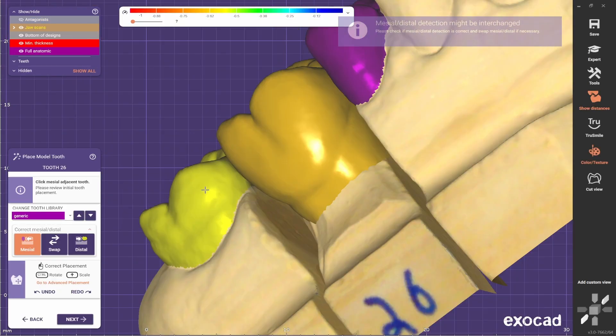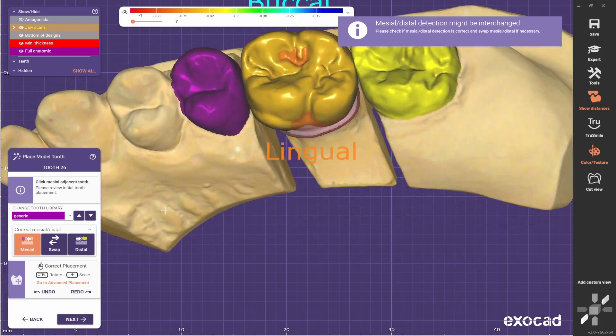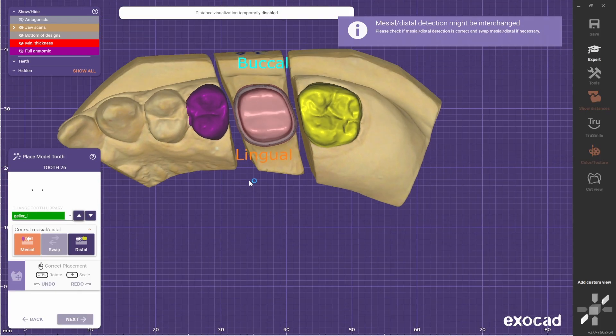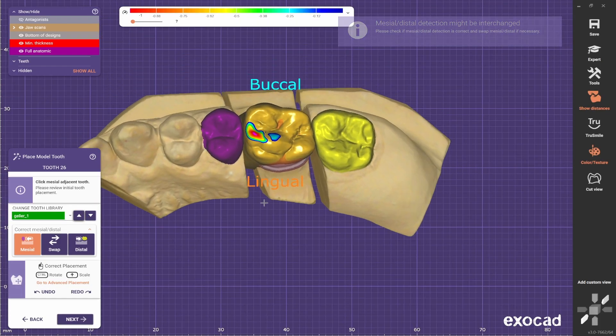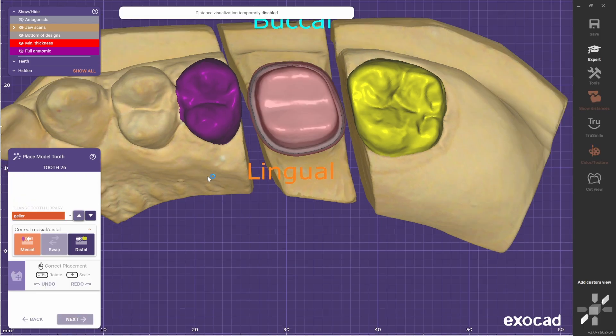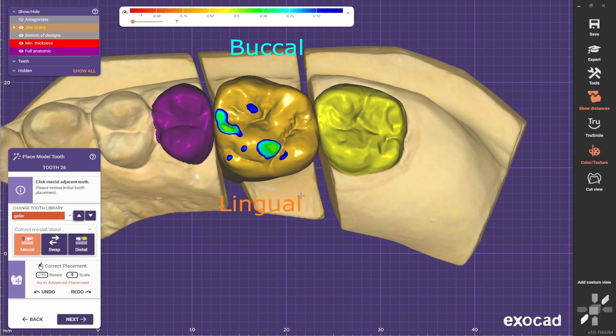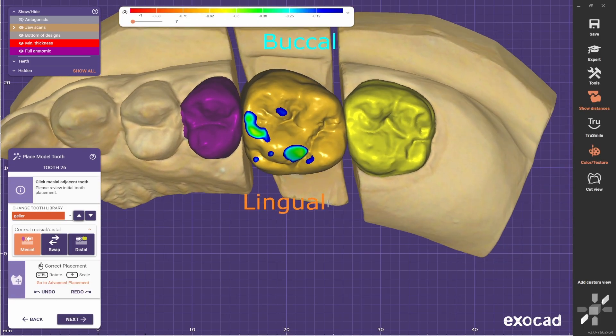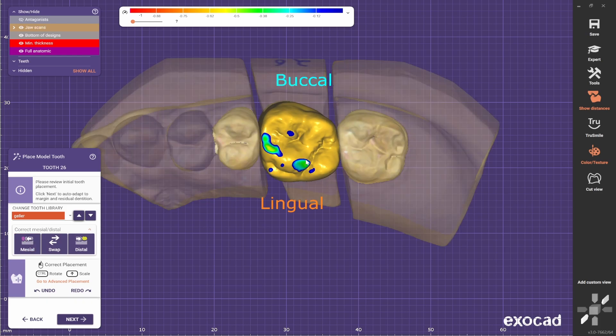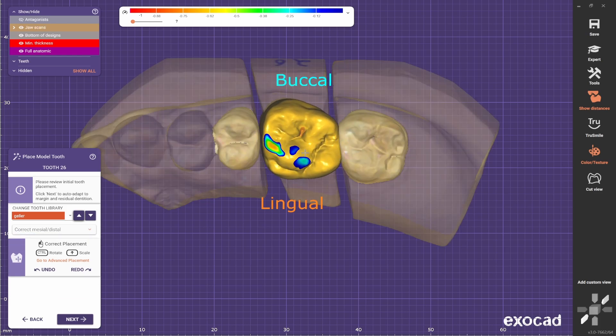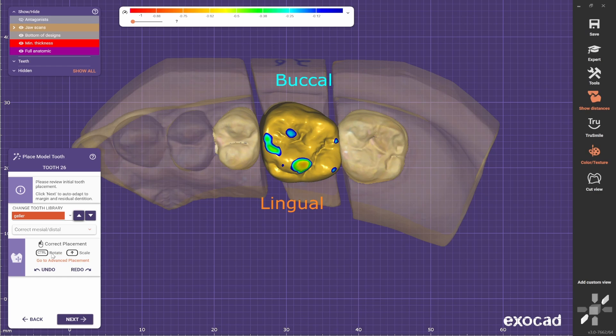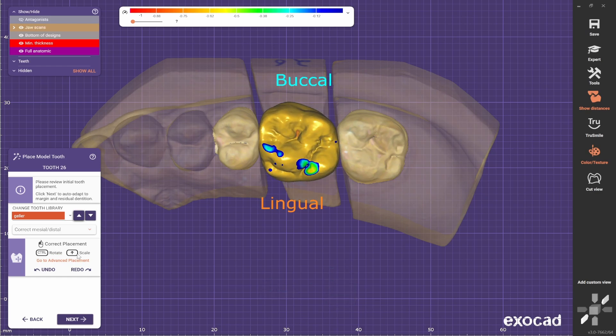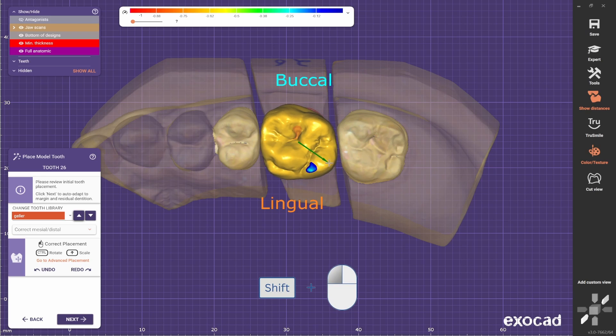Now here you select from the library the morphology that most resembles the patient's morphology. So I'll choose this one. Now you can place it, so you can drag it all around. You can use the control key to rotate it and the shift key to scale it up or down.